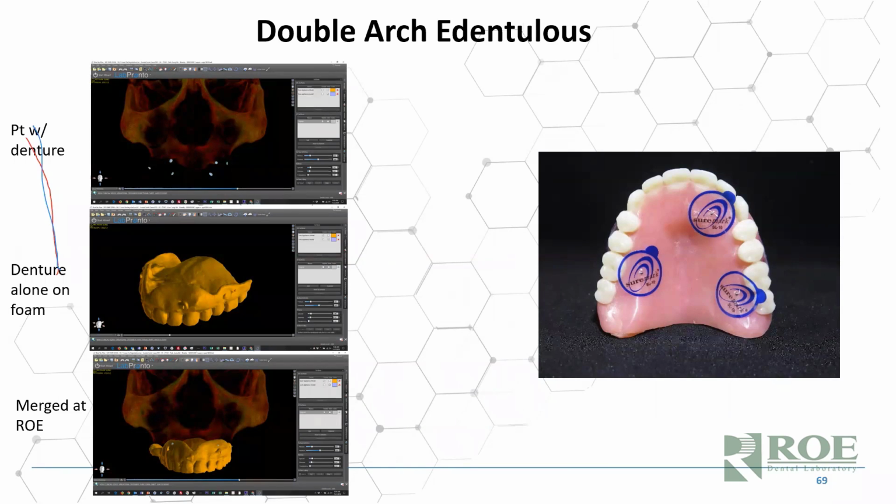And this is what they should look like on the CT scanner. So this above is the denture seated. These are markers. We recommend using SureMark. You can order them from us. You can order them right from the company, suremark.com. And there's 6 markers in here. And here you see only 3, but there's also 3 on the labial buccal of the denture.